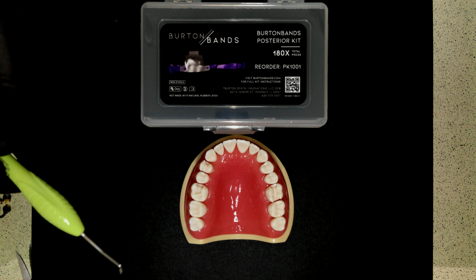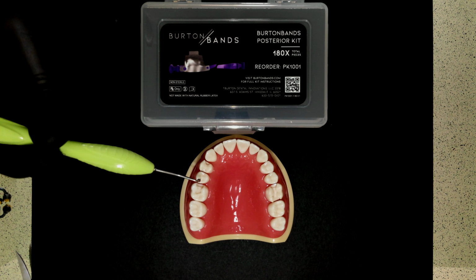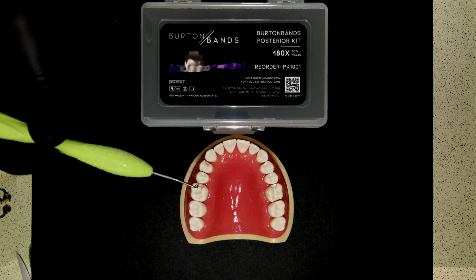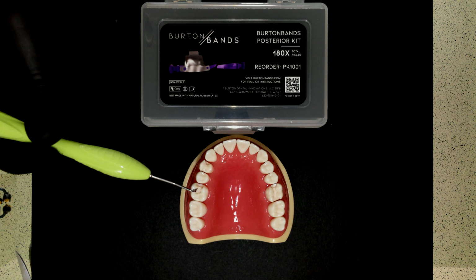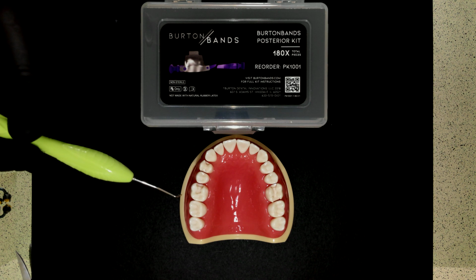And so the basic one is any single isolated class 2 situation, so not a back-to-back. Back-to-backs do not go well with this system, and so it's best if there is intact adjacent tooth to perform against. And so any isolated class 2 that is not super wide, but it doesn't have to be ideal. You can break contacts. These matrix bands are plenty big to handle that situation.